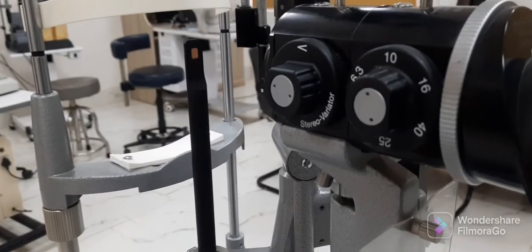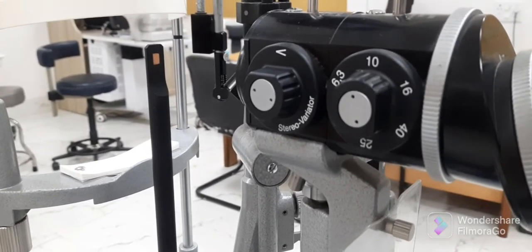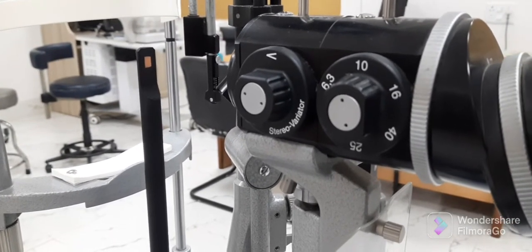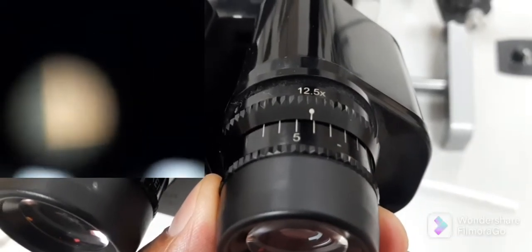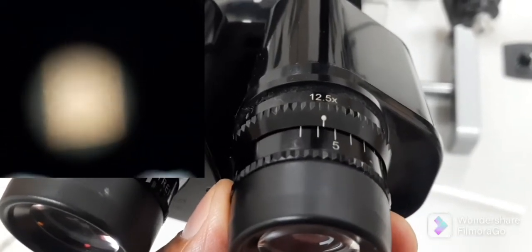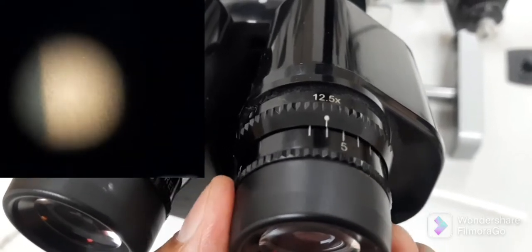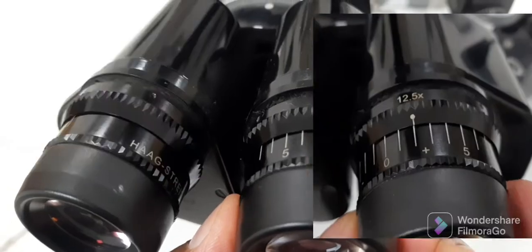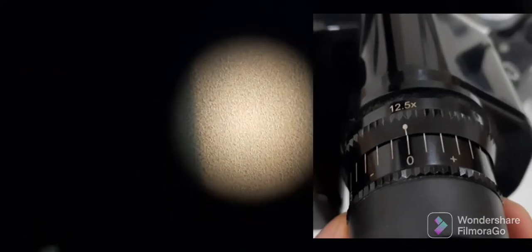Now when we switch on the slit lamp we can clearly see the target that we have to focus through the eyepieces individually. Now we can see both eyepiece and the target in the video. Let's suppose that our examiner is emmetropic, so when we rotate the eyepiece dial towards the zero, as you can see the target is very crisp and clear - this is the final point of focus.